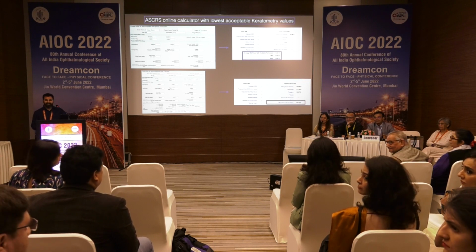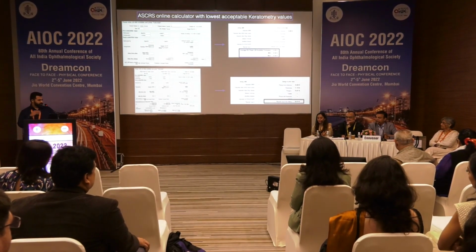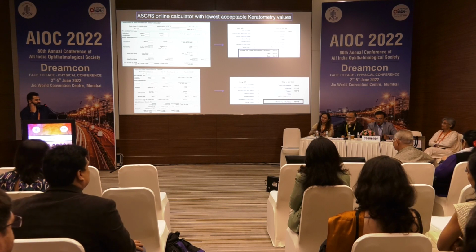I have a question. Would you just go ahead and put a lens there and then do a piggyback for a residual? You could, but you don't want to do a piggyback, right? I mean, that should be your last option.